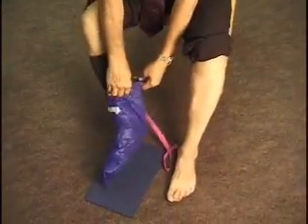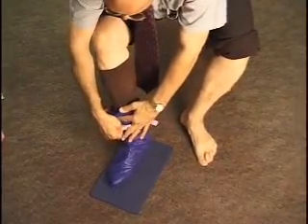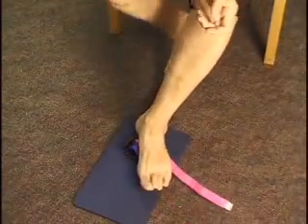Removing the stocking can be facilitated using a special device which is very slippery. This device is made of sailcloth, and as you can see, you fasten a Velcro strap first. It is important to pull the stocking over the heel, then with a scraping motion, the stocking can very easily be removed from the leg.